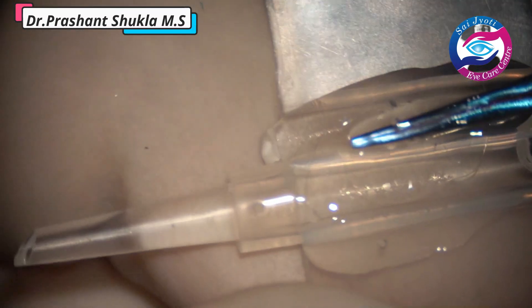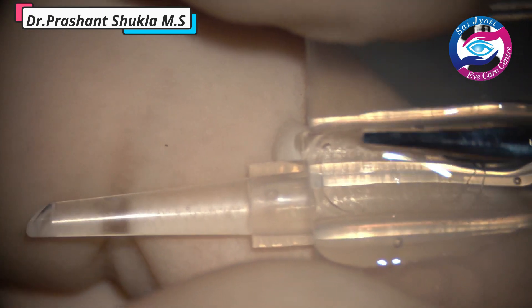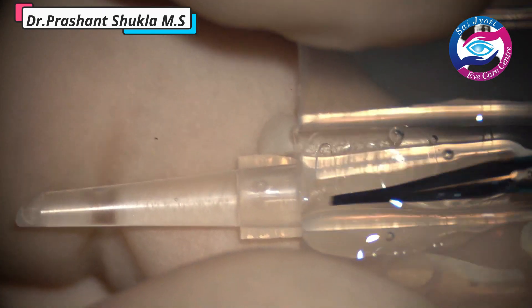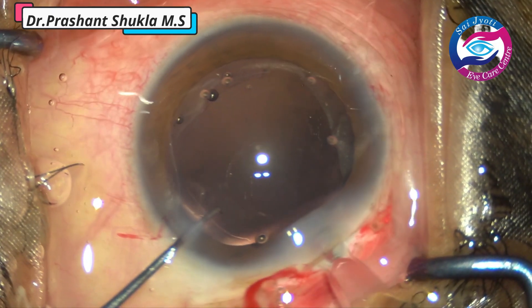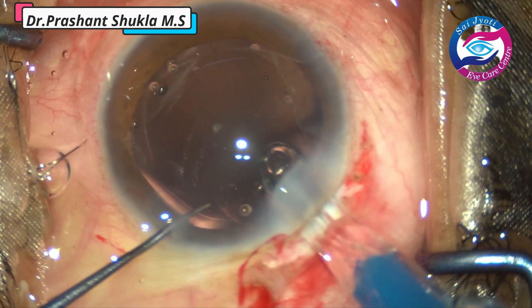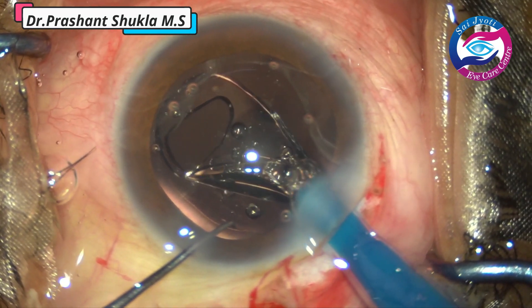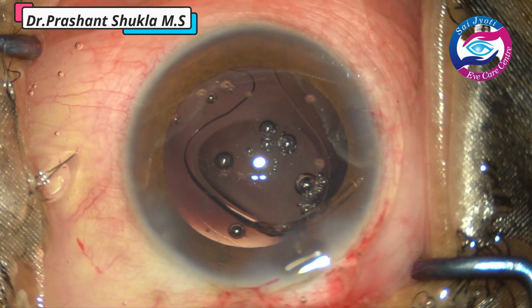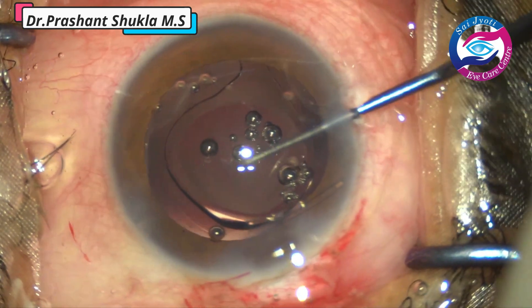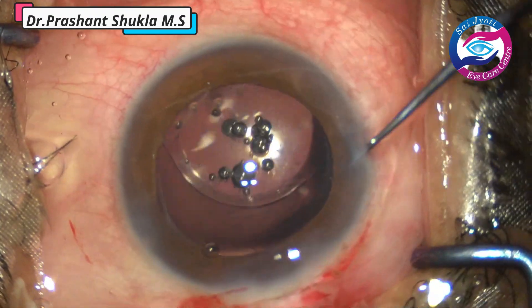This is how we load a foldable hydrophobic intraocular lens. The viscoelastic is instilled into the butterfly cartridge and the lens is placed in the proper orientation. With the help of McPherson forceps the lens is positioned and the cartridge is closed. Gently pressing the plunger of the cartridge, the haptic is directed towards the capsular bag below the anterior capsular margin. The optic-haptic junction is then held with the Sinski and the intraocular lens is dialed into the capsular bag.